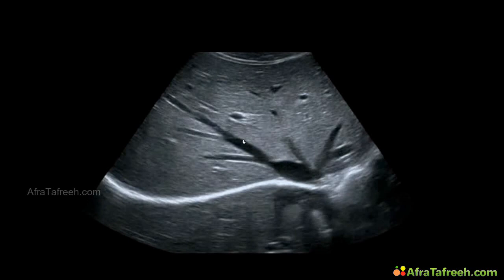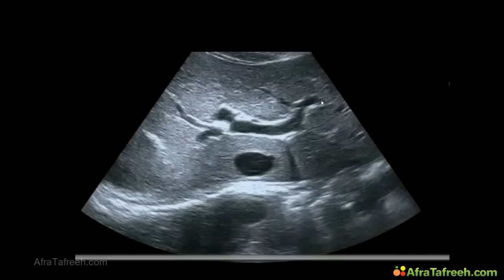Show us again, please. Yes. So here the liver vein, nearly no border, and over here bright echo around the branch of the portal vein over here. So you've already seen the porta hepatis in the last video clip, and here you have this view, the level of the portal vein.